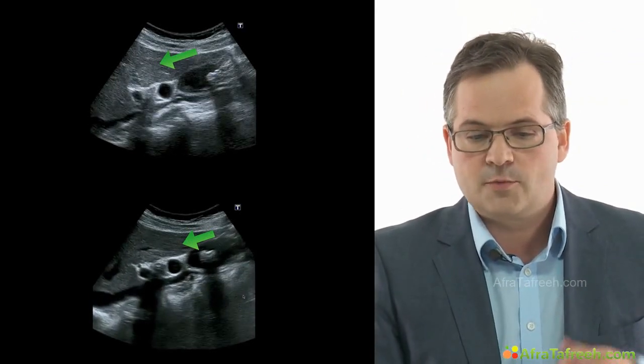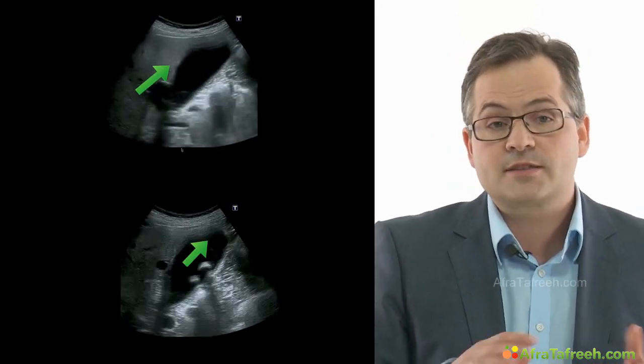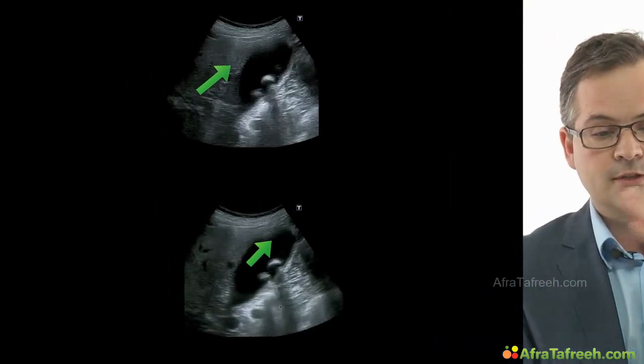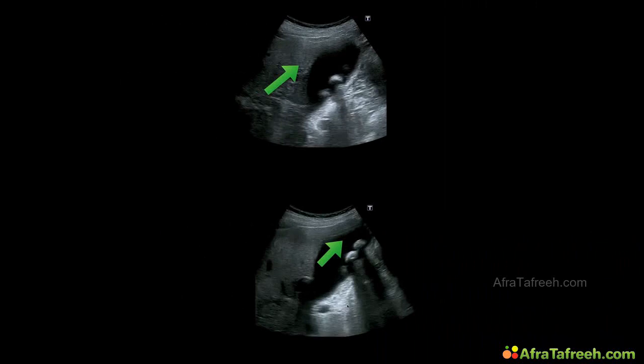So maybe from a supine position to a standing position of the patient, we see this movement of the stone over here. And in this case, I ask the patient to roll over on the other side. And what we see here, also the gallstones in the gallbladder are rolling to the fundus of the gallbladder. So these are really rolling stones in the gallbladder.